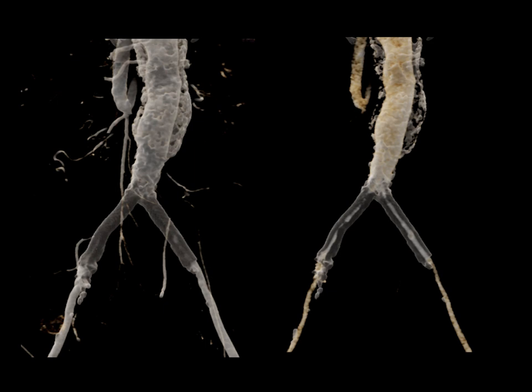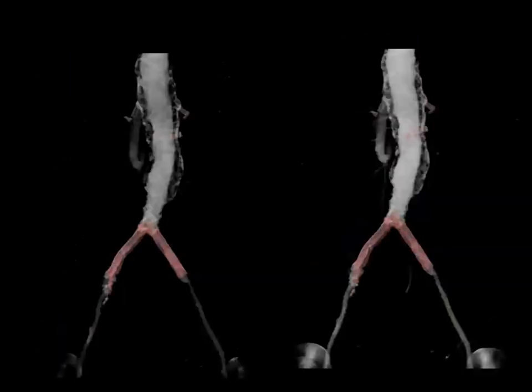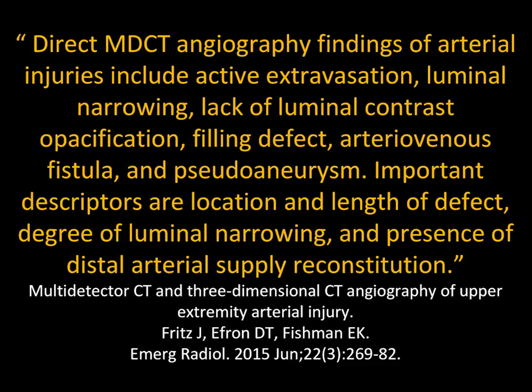Here I've done some cinematic rendering and I'm showing you the stents and I'm showing you the flow of contrast in the stent. You can see on both images the contrast is really there when I bring it out. But it's very easy to make a mistake. So indeed you want to be very, very careful. Again, there are all sorts of challenges.